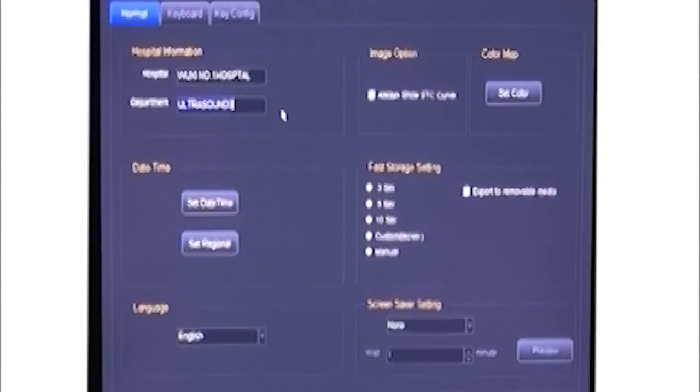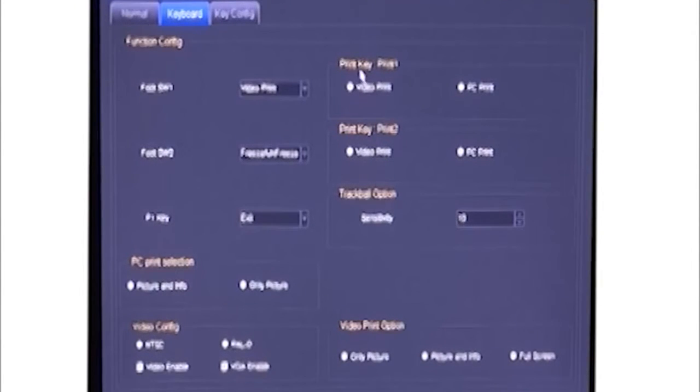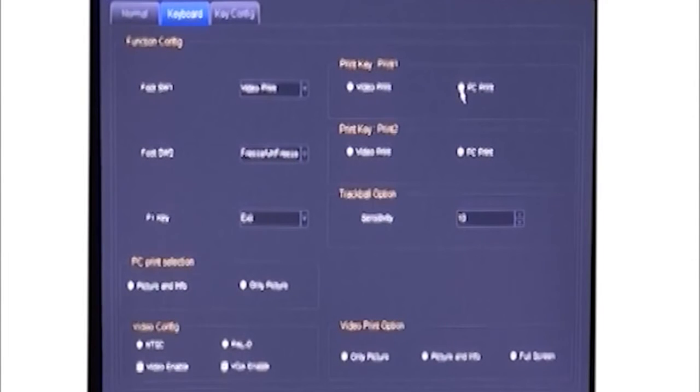There is a printer key on the keyboard. We can define its function here: video printer or PC printer. Also, we can choose print area.